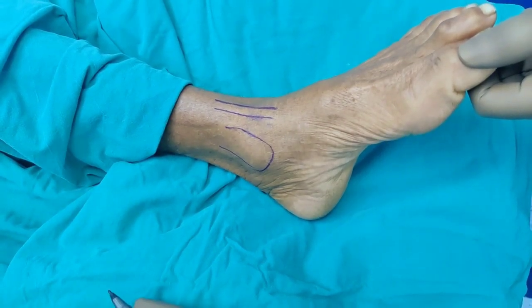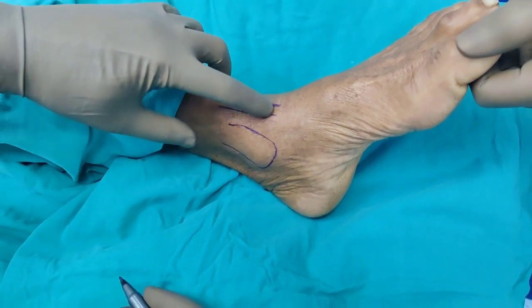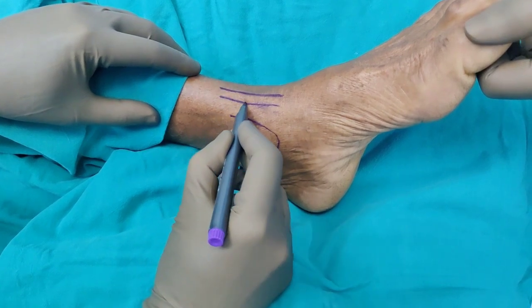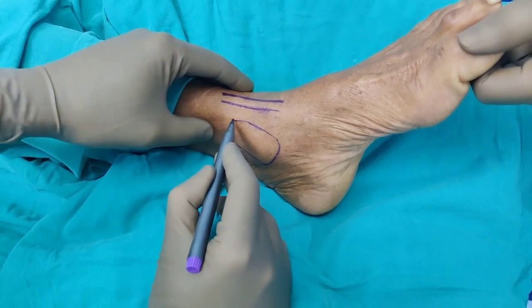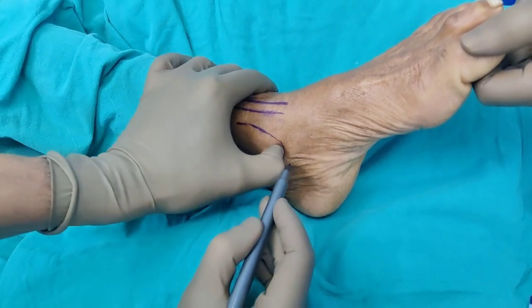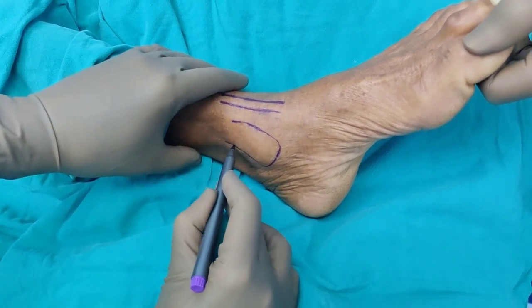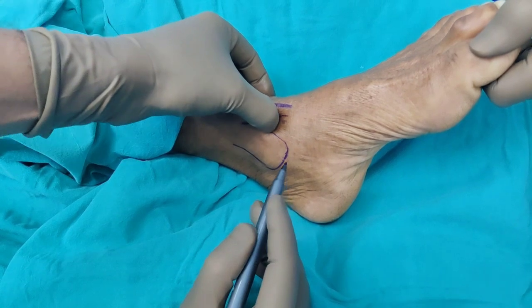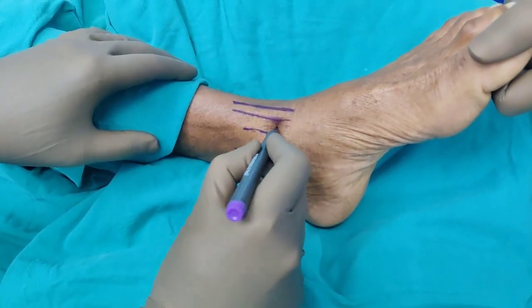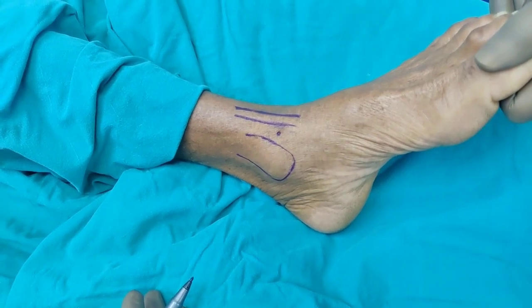When you are injecting an ankle, it is extremely important that you identify the landmarks. This is the tibialis anterior tendon, which I have highlighted here. This is the anterior part of the medial malleolus, this is the tip of the medial malleolus, and this is the posterior part. In between is the soft spot, roughly here — and this will be the spot through which we are going to do our injection.